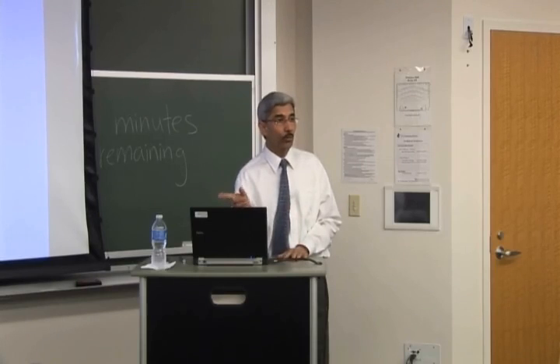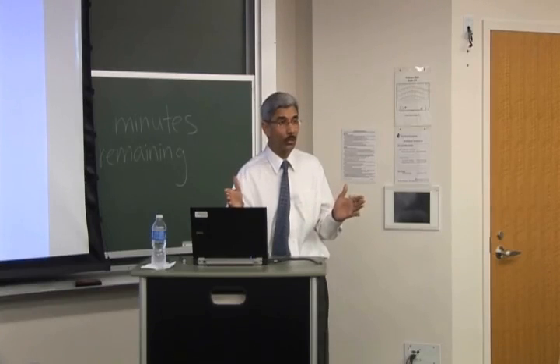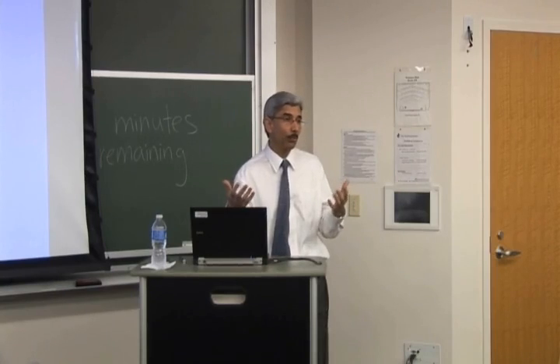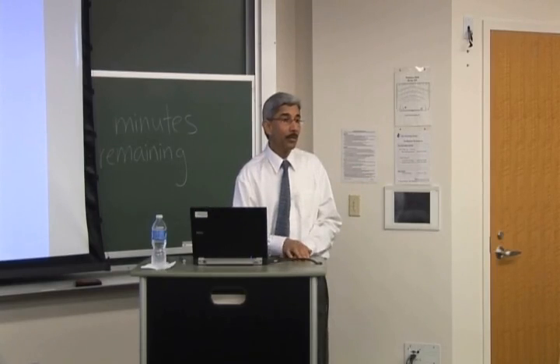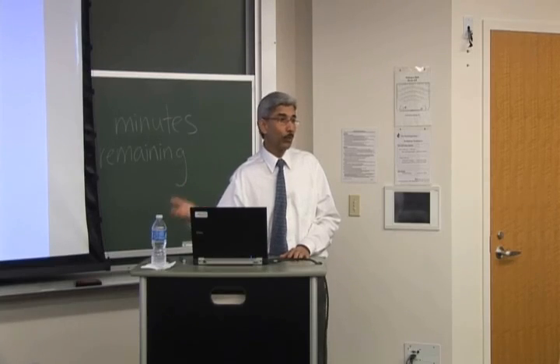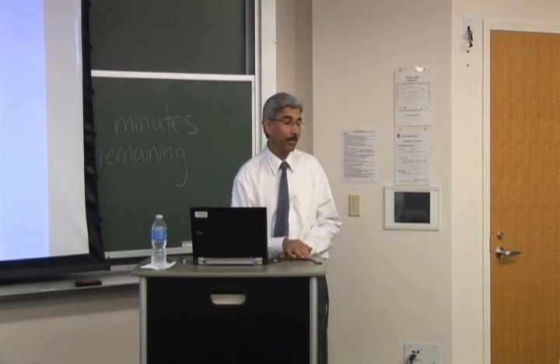On the other hand, those who are responders and are in what we call New York Heart Association class 3 and 4. Class 3 is very symptomatic with slight activities, and class 4 is symptomatic even at rest, with a lot of breathing difficulty. Resynchronization therapy has certainly moved the patient from 4th and 3rd class to 2nd and 1st, in some cases class 1 and class 2.